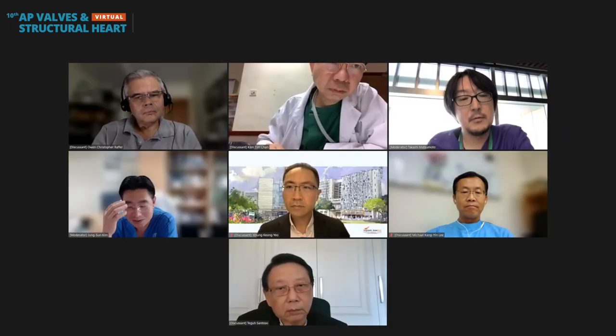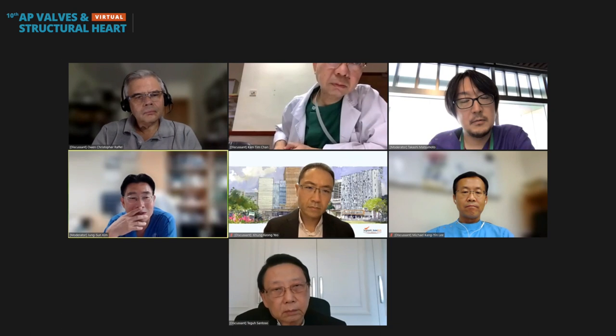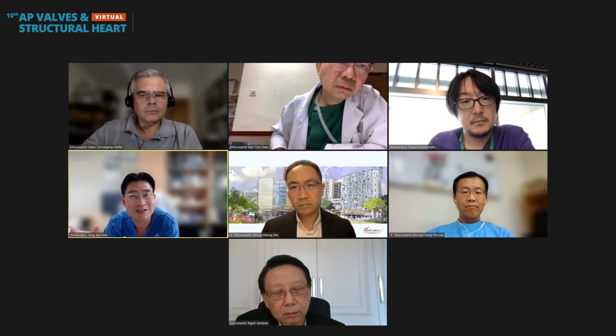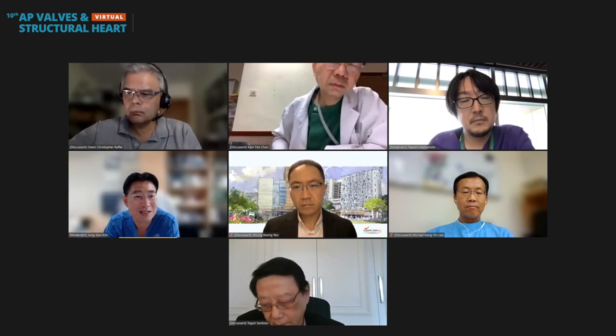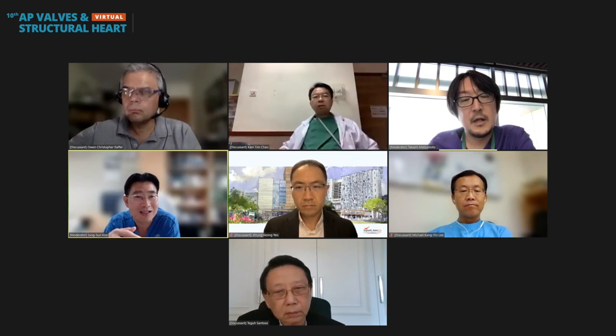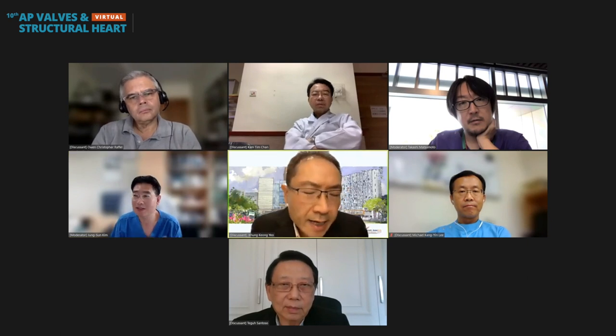Actually, we have a little experience with that. Recently we introduced the G4 system. At first, as you recommended, we try to use NTW, but sometimes it is not so easy to grasp in this kind of case. So in that situation, we change to the XT. I see, your XT. In that situation, I use independent grasping. How about KK? The size of 3.5 or not, I don't have a strong feeling about it.